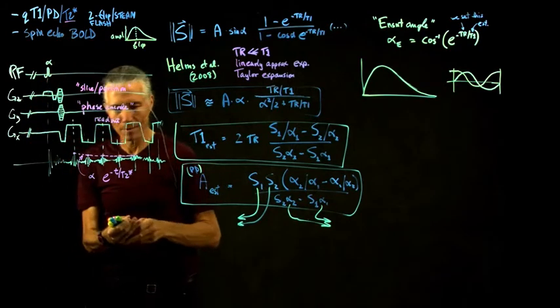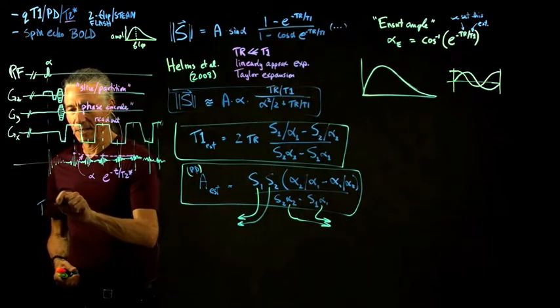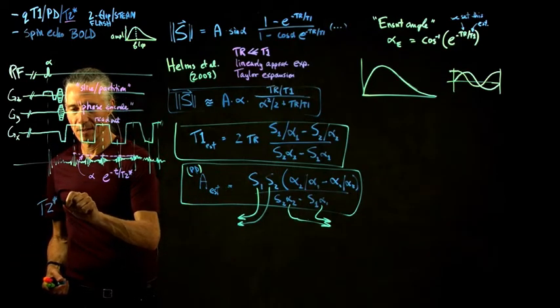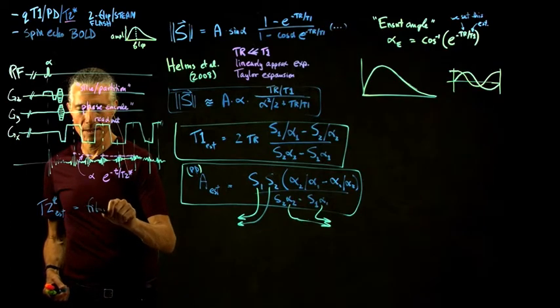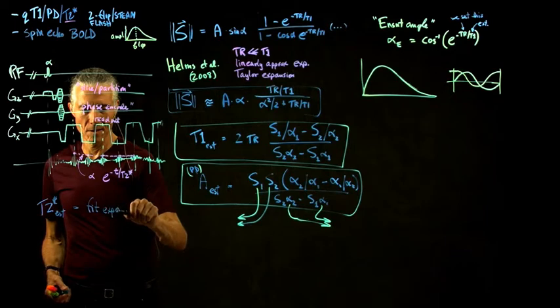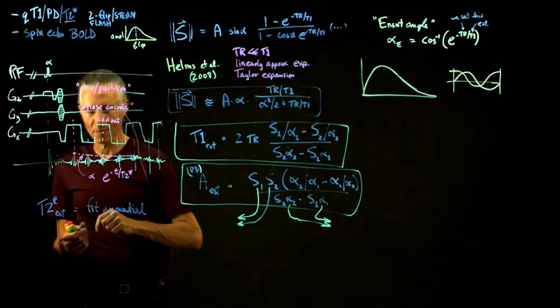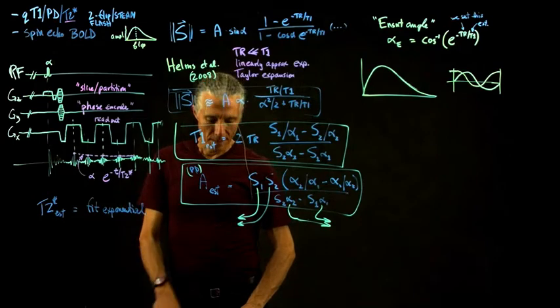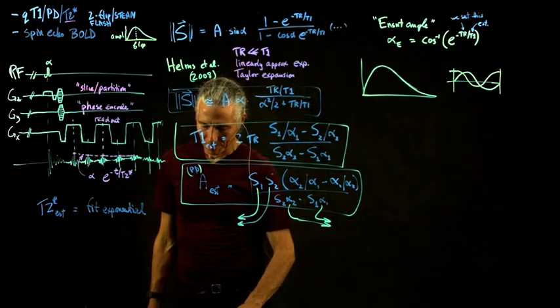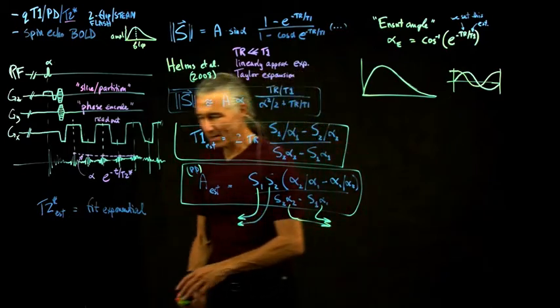Basically we would get a T2 star estimate by fitting an exponential. There are some constants in there that I didn't explain, but you can see that you've got a bunch of data as the signal is decaying away, and so you can actually fit it. So okay, that's good.